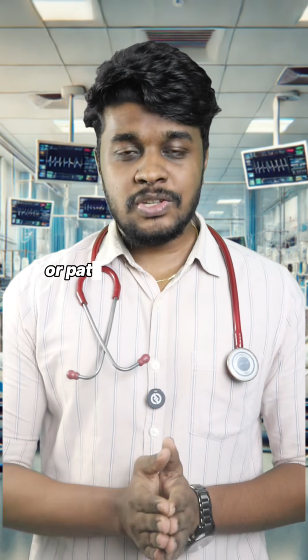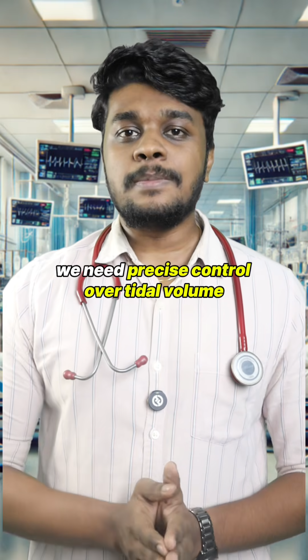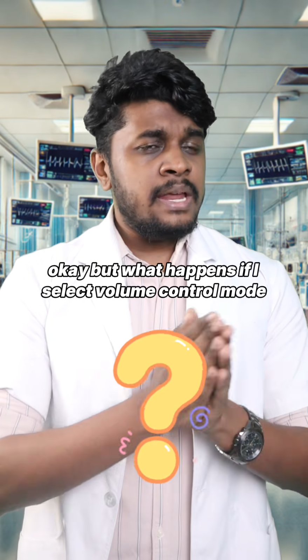Whereas in post-operative patients or patients with stable lung mechanics, we need precise control over tidal volume. So we choose volume control mode. Okay, but what happens if I select volume control mode in an ARDS patient?